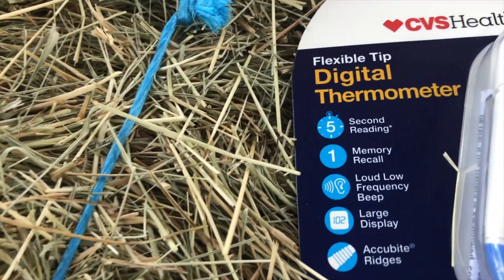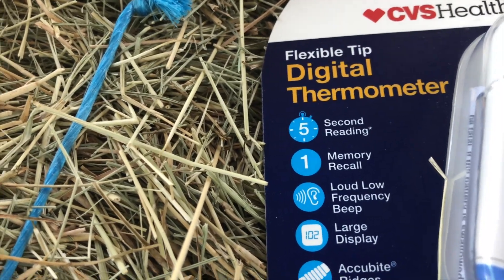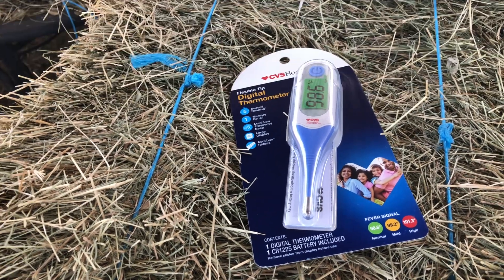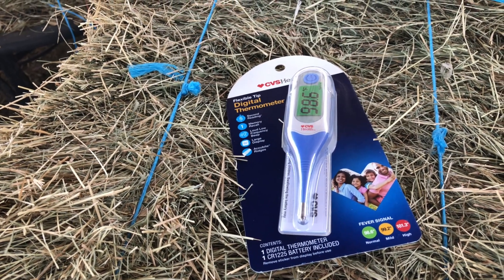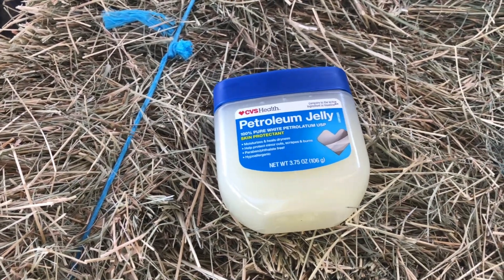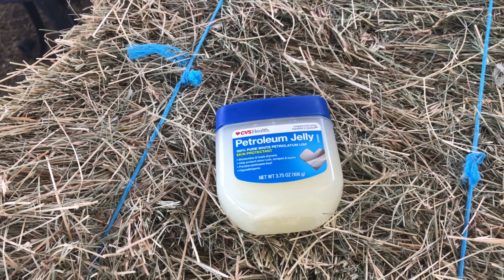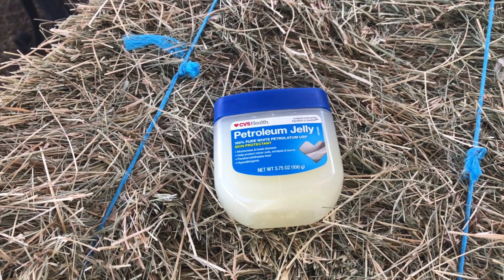A few extra dollars at my CVS pharmacy got me this one with a five-second reading. Not very expensive — I think it was about $17. I would recommend this to be in your goat bag of care. Number three: for the goat's comfort as well as your ease of doing this procedure, you have to have some form of lubrication. I opt for good old petroleum jelly. Some people use KY or other medical lubricants, but petroleum jelly works every time.